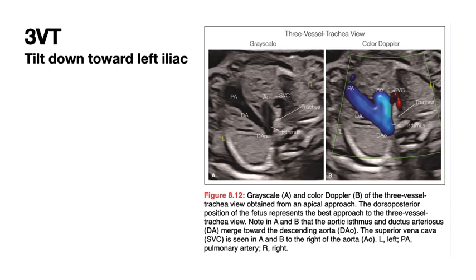Well, maybe you're a little bit higher than right ventricle. So that's what the three-vessel trachea view is. And you've got your pulmonary artery basically going straight back, and then you have your transverse aortic arch heading back and joining the same place.